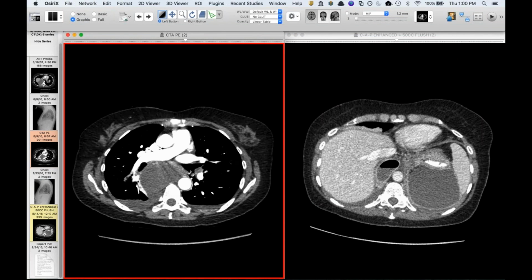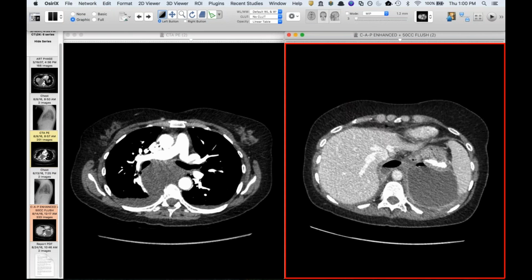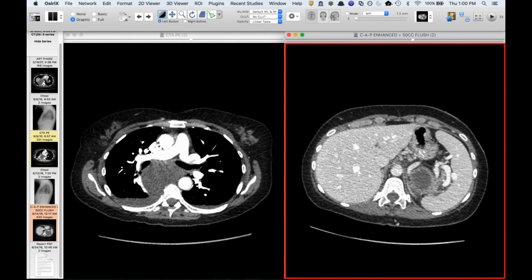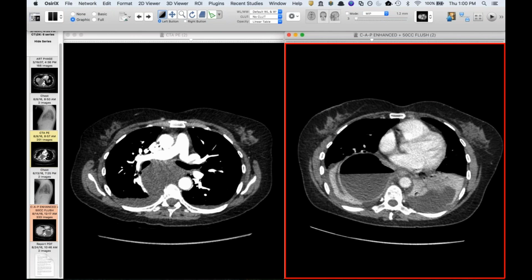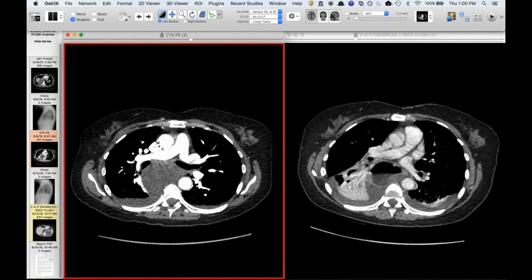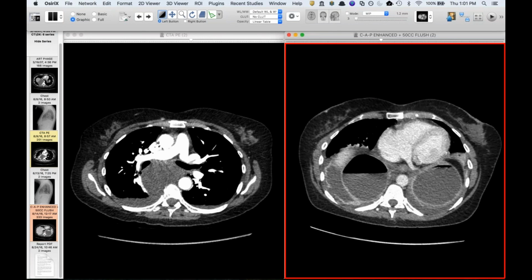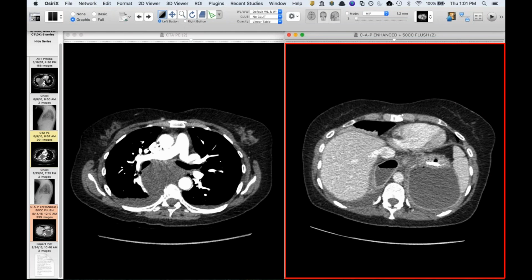Yeah, I've never seen a duplication cyst that large. Never. No. But yeah, Jeff, my first thought when I saw the CT was that she must have had pancreatitis at some point, and that this was a pseudocyst that had tracked up. Because I think even you've shown one of those that was that large. Yeah, they're huge. I mean, they look like a giant empyema almost. This one doesn't look inflamed around it. The way those are inflammatory, and there's a lot of muck in the mediastinum, and everything looks clean here.